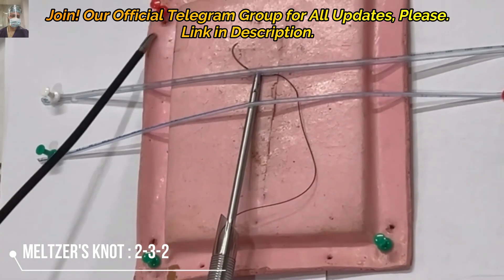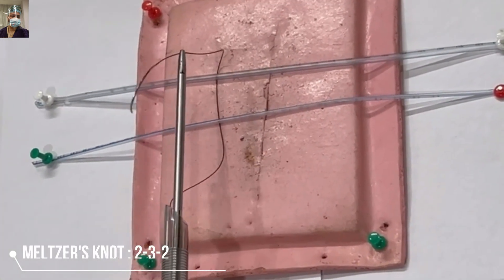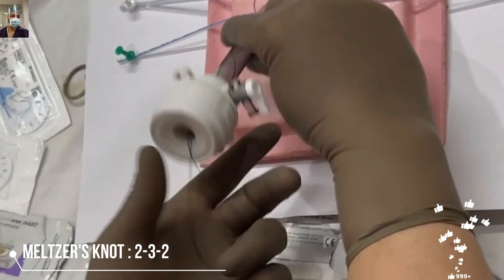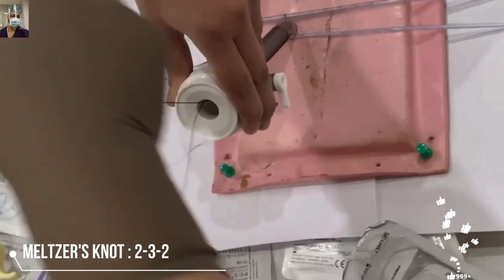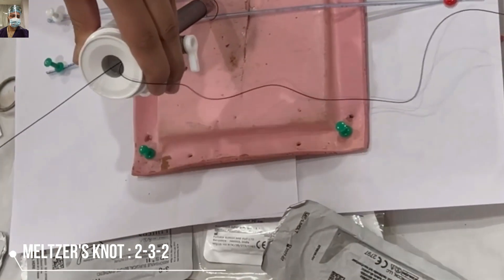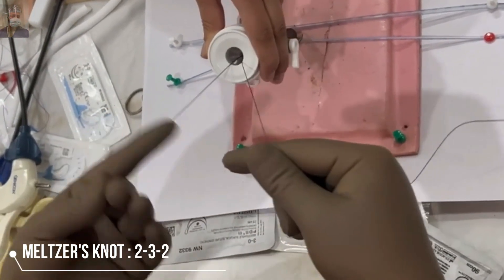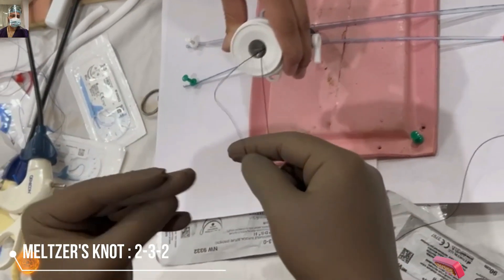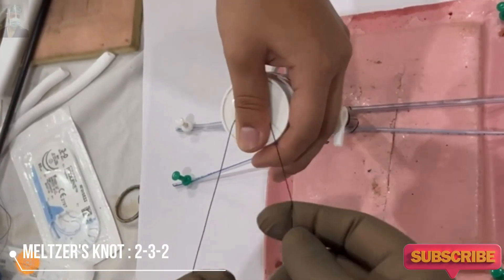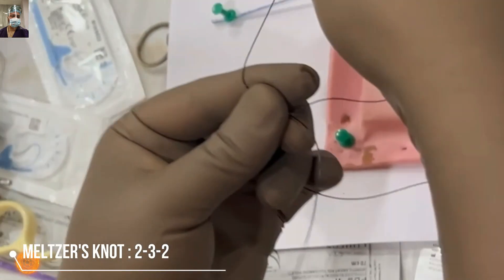We are using number one nylon here, as Melger's is a more secure knot and is basically designed for monofilament sutures. After encircling the structure, I have taken out the needle — I will make a short video on how to pass this needle. I am holding the tail end with the help of a haemostat, and my daughter is helping me in this video. All the movements should be with the help of your hands and you should not be too dependent on assistance. The assistant will keep a thumb on the exit port to stop gas from leaking and to keep the longer left suture separate.